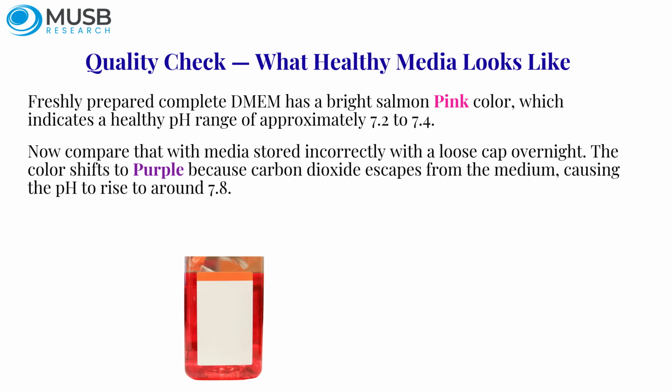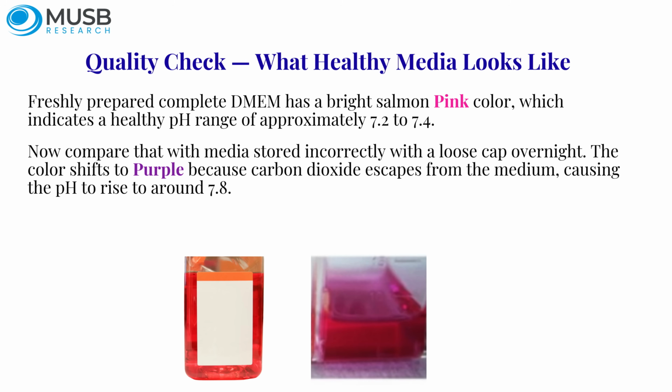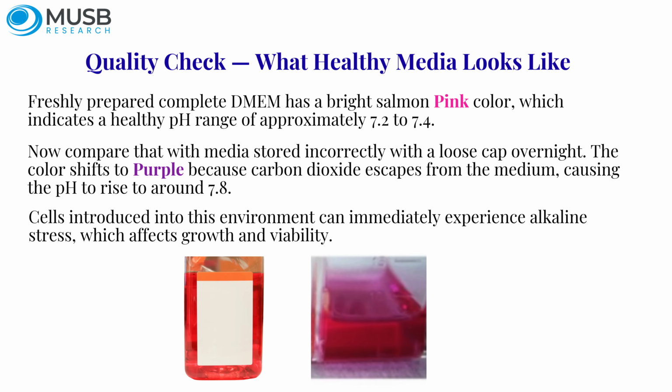Now compare that with media stored incorrectly with a loose cap overnight. The color shifts to purple because carbon dioxide escapes from the medium, causing the pH to rise to around 7.8. Cells introduced into this environment can immediately experience alkaline stress, which affects growth and viability.